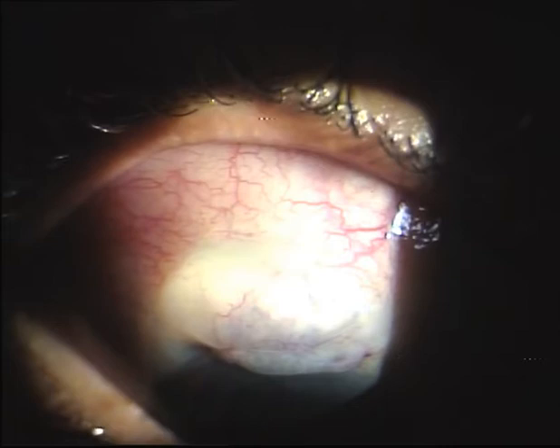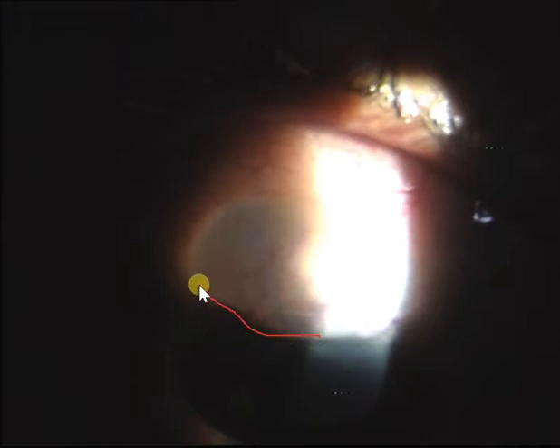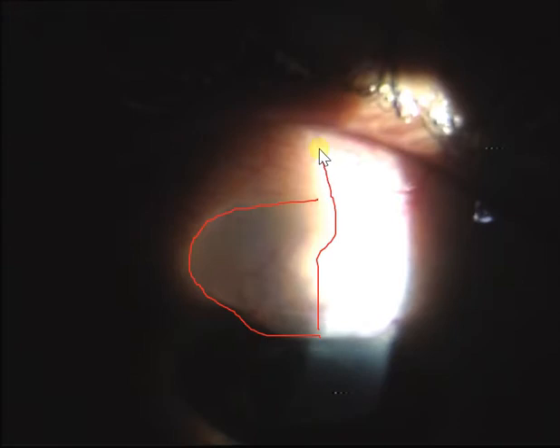Let's see how we assess this bleb as a routine. We need to shorten that slit beam, and then in order to see if this is a cystic bleb, you can do trans-illumination. Here you can see that there is trans-illumination — this is the slit beam coming in, and this is the area of the bleb which is trans-illuminating. That tells you it is an avascular bleb and that the bleb is actually well-formed.